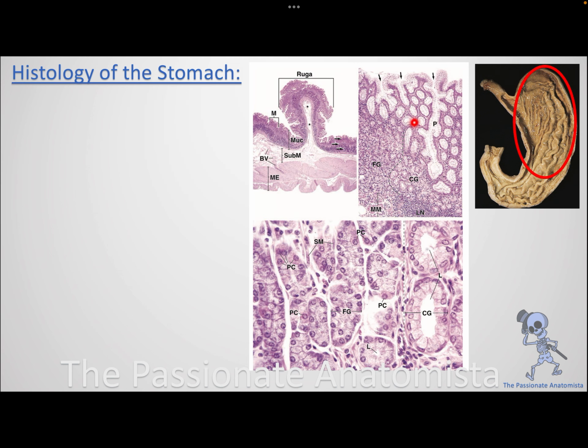If I look at a higher magnification, you know that the gastric pits are lined by the mucus cells. It means that I can see white things. I can see cells that are losing their content, because remember, in histological preparation, we lose the fat, the mucin, and the glycoproteins in my cells, so it looks white.